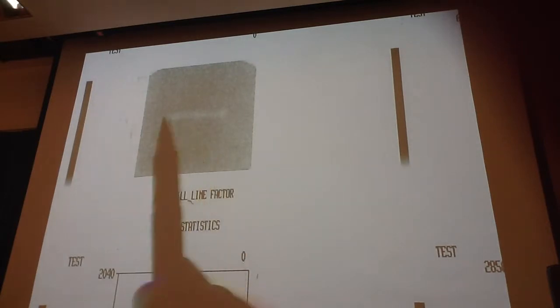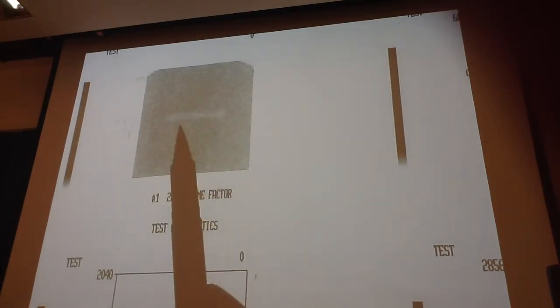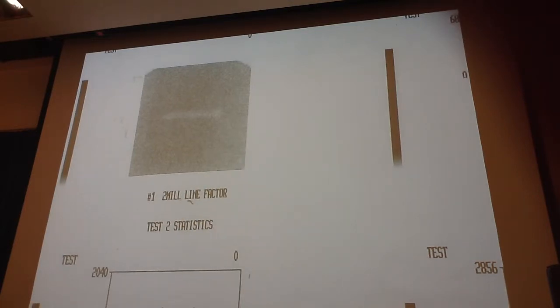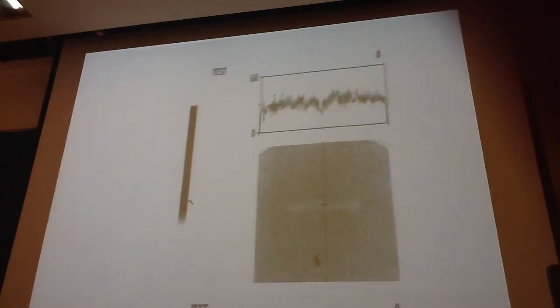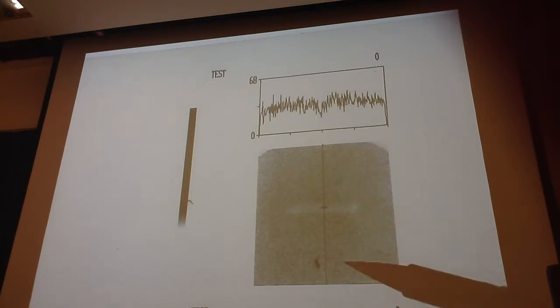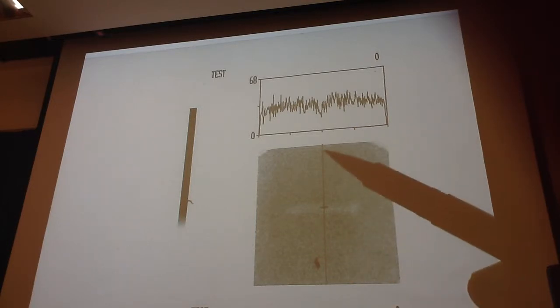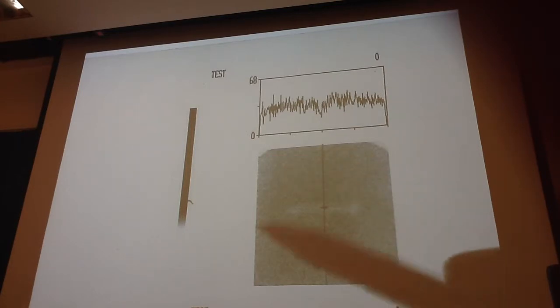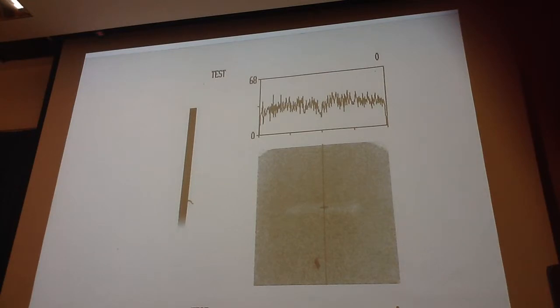But I had a small 1mm piece of lead. I put it on my flood, and I took a picture of it. And then, just for the heck of it, I put a profile slice through it. You know what profile slices are? Have you guys done those? When you create a region of interest, you're actually creating a profile slice. But basically, it just tells you the counts that are going in this direction. You can do these things diagonally, horizontally, vertically, any way you want.